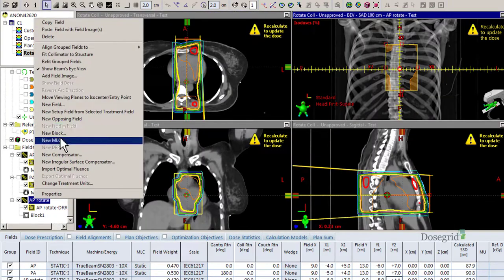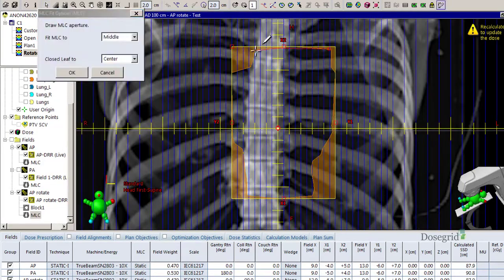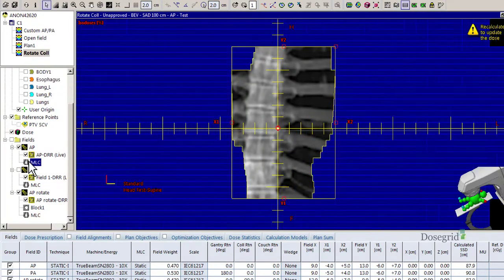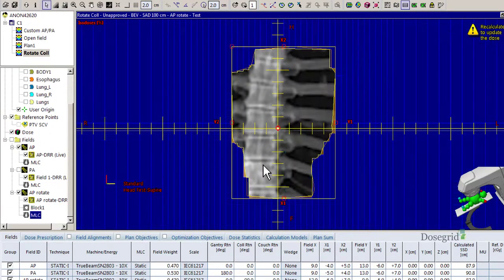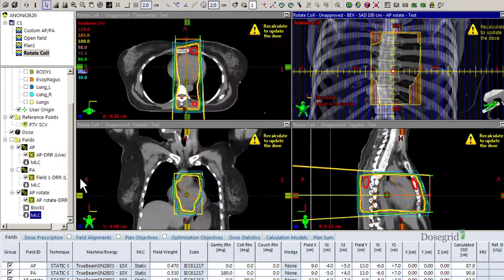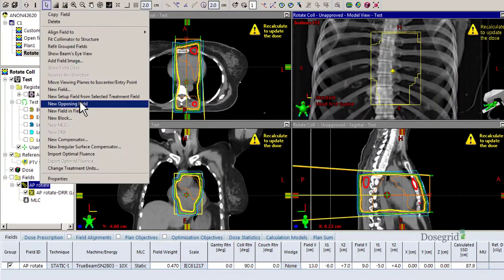Using the MLC drawing tool, recreate the MLCs by using the block as a guide. Now you have the same fields with the collimator rotated and the original blocking. Delete the original fields.